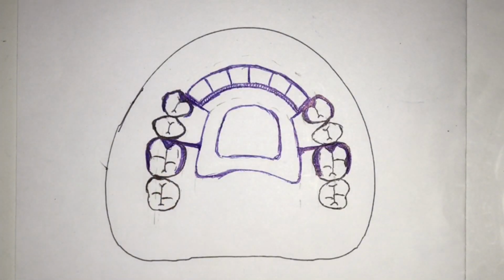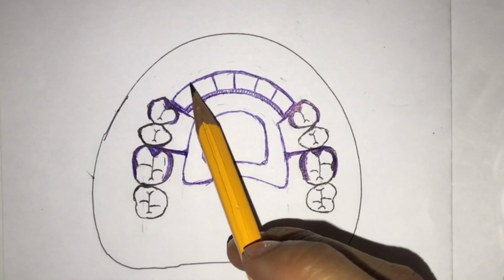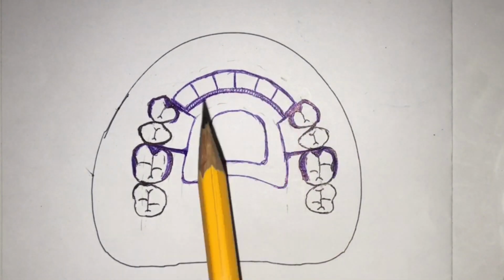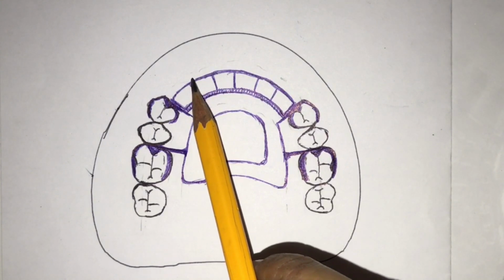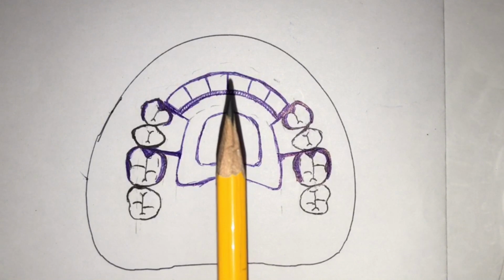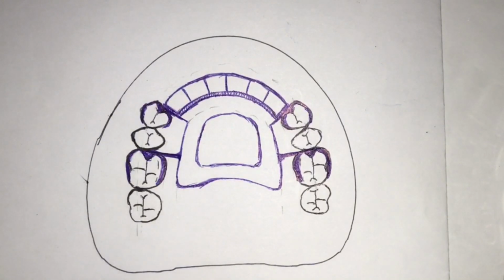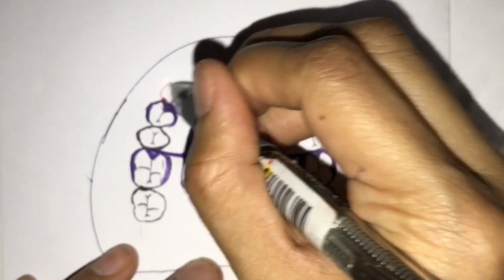So there. So if you're going to ask again, can I use an I-bar in this area? You may opt to do so, but an I-bar coming from the anteriors will actually be seen in your denture base. So what do I mean? It's going to shadow the denture base. So if you have your denture base, for example, here, just imagine that you already have your pontics there.